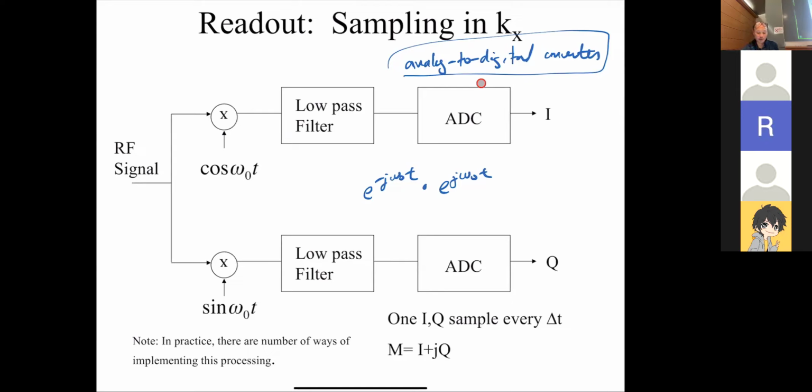So it does two things. An ADC actually does two things. It samples your data, right? So that's what we talked about, and it quantizes the data. Okay, so we're not really going to talk about quantization in this class, just because it's sort of out of scope. So for this class, it's more just sampling your data, and it's quantizing it so it can store it as numbers.